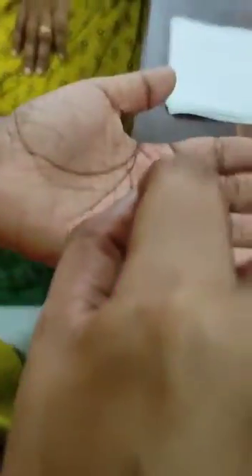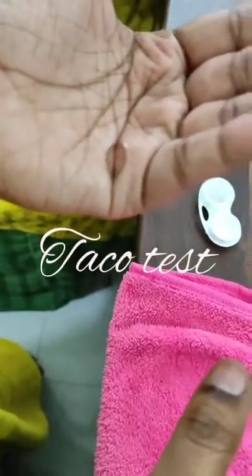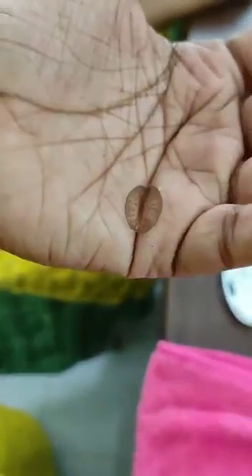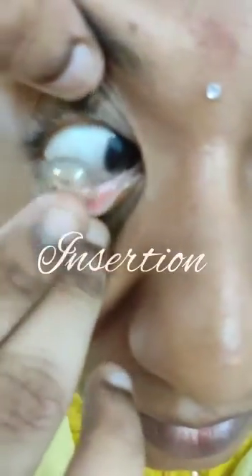The next step is the taco test. If the lens is in the correct position, it will be in the shape of a cup. If it is incorrect, it may be shallow or pointed at one angle. While placing the lens on the palm's corner, look at the shape of the lens. Now it is in a perfect cup shape — ready for insertion.